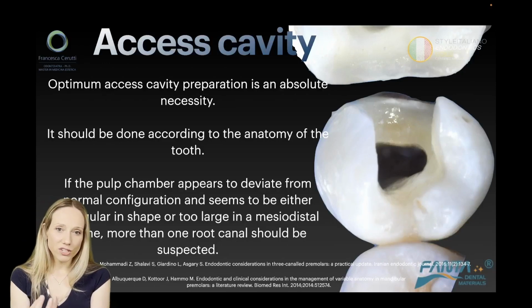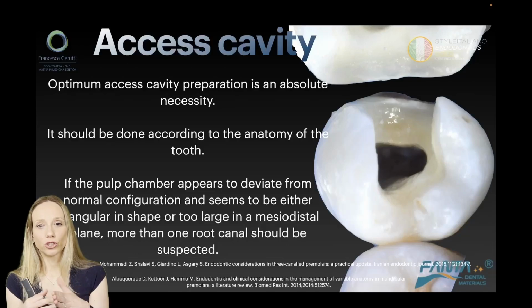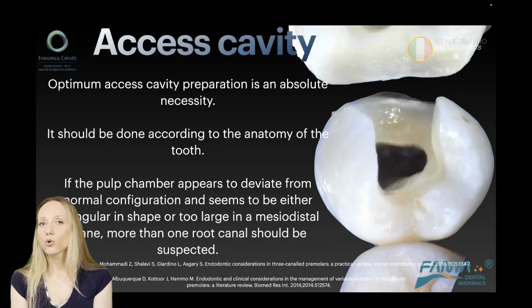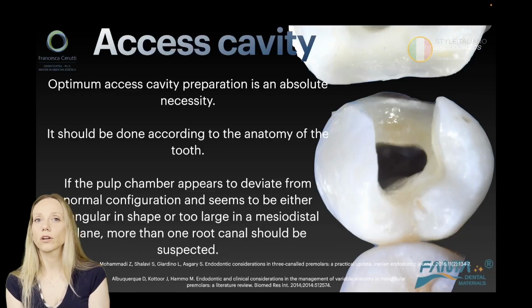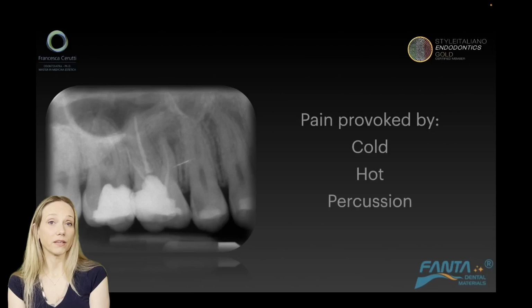the better responding to the anatomy of the pulp chamber. So, for example, if I'm used to doing an access cavity in premolars that is like an oval-shaped access cavity, if I am thinking that there could be some variation, I have to make it more triangular. Because if I think that there are 2 roots or 2 root canals buccally, then I have to make room for my eyes to see those openings. So my access cavity will be triangular.